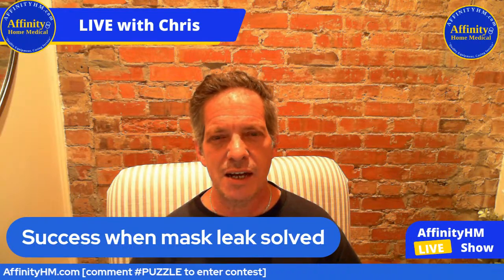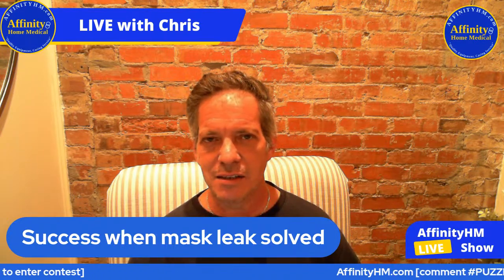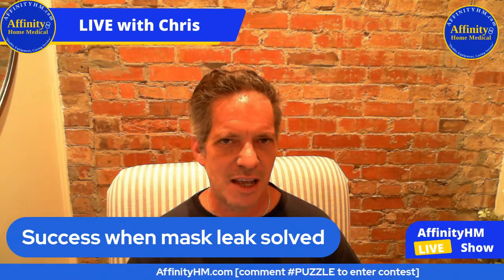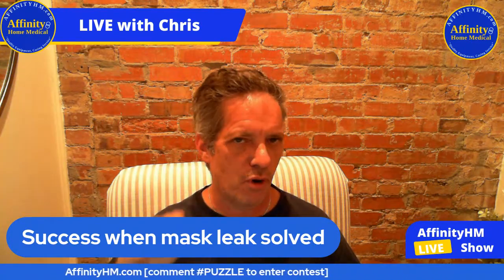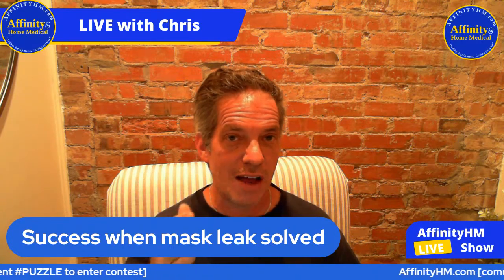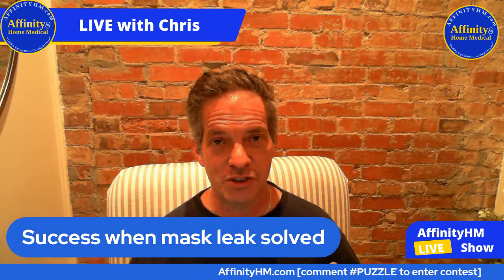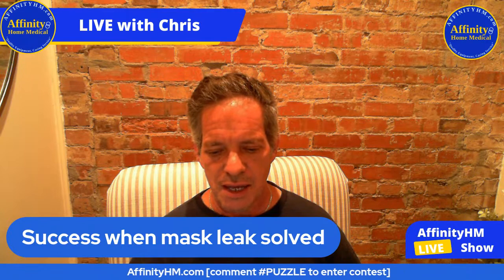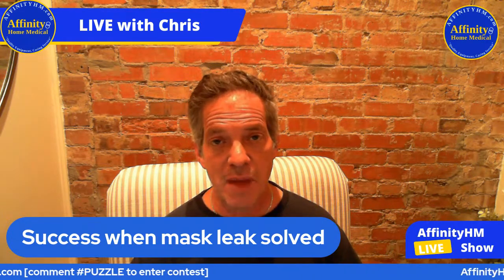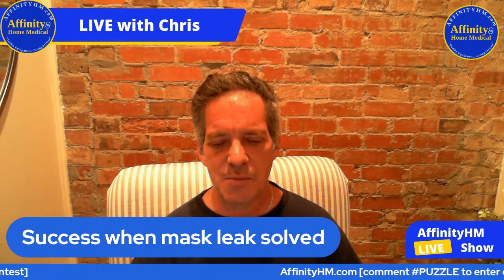An interesting thing to understand is that when a mask leaks, the machine's algorithm is set to try to achieve a pressure. So when the leak is happening, the machine actually drives more, which can exacerbate the leak and make it even worse than it already was. So in order to solve a mask leak, you are going to have to try different masks or different mask sizes, and just stick with it and keep going.